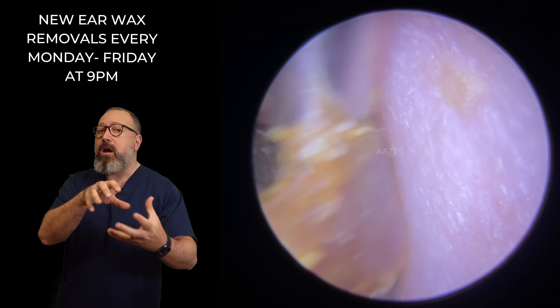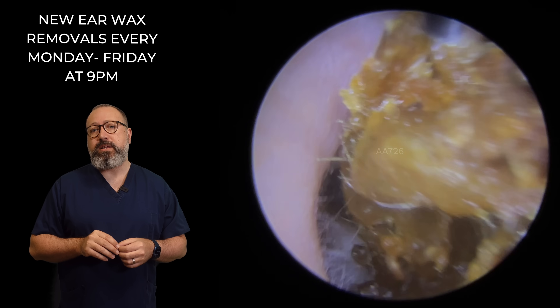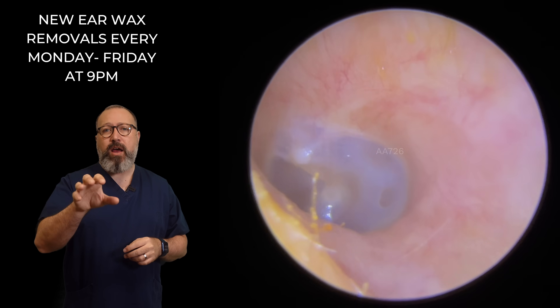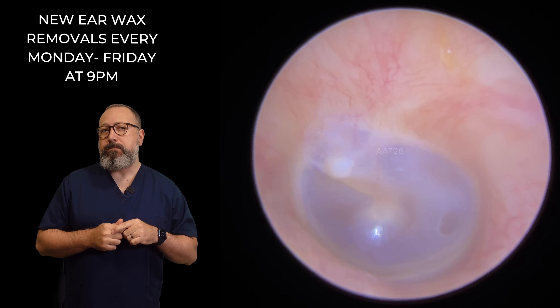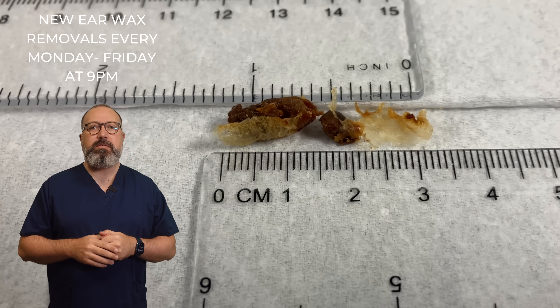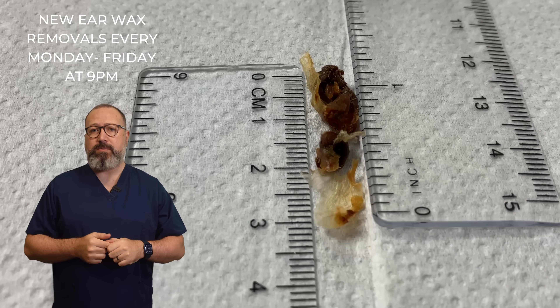It jarred just a little as we pulled it out — there's a piece of skin that's dried into both the wax and the canal wall. As we take this away you can really see that long strip of skin hanging off one side of the wax plug. The wax is looking very dry. What eardrum is this — is it pointing to 11 o'clock or 1 o'clock? It's a left eardrum! We've got between three and three and a half centimetres — just under an inch and a quarter including the skin cells. You can really see those long strips of dry skin and that tough old wax plug.